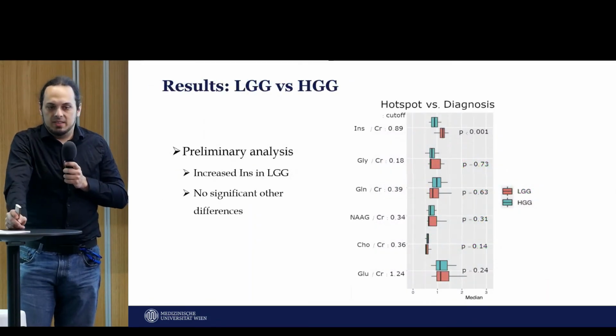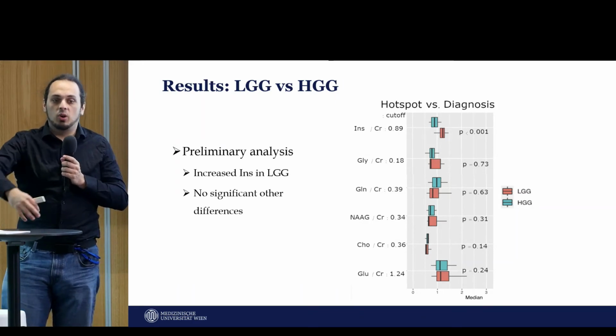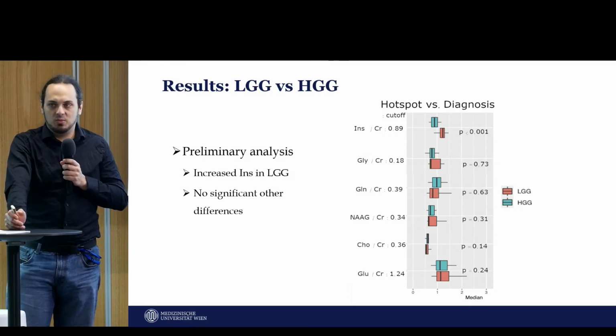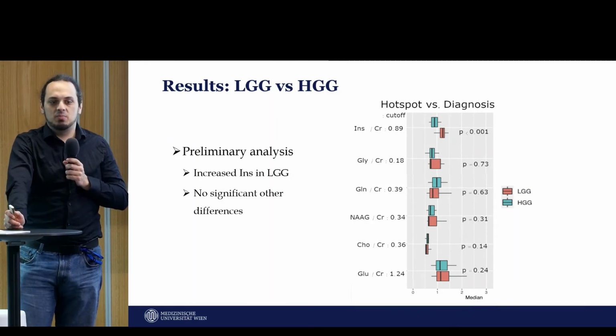And at the ISMRM time, this was basically the state we had. We have since refined the model, as we'll show with a newer result later. If you then go to the distribution over all these patients, things start to look less fancy. While we have these very nice hotspots, if you do these ratios and then look at the statistical distributions, you still see that the range is incredibly wide.